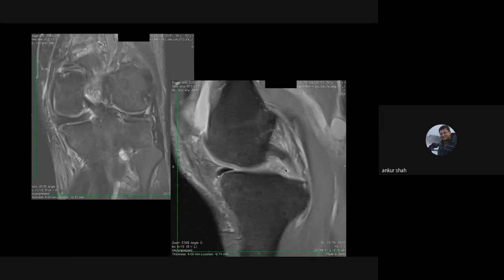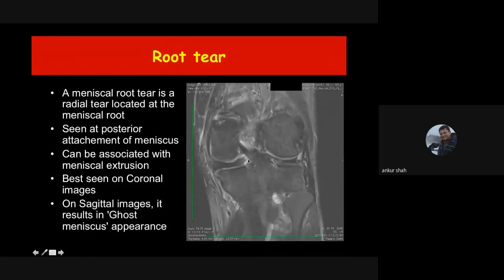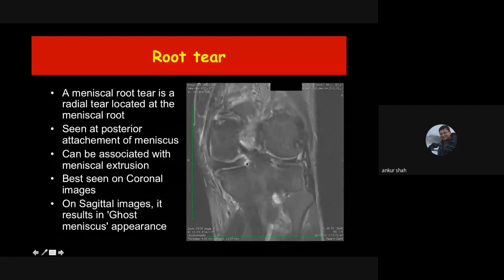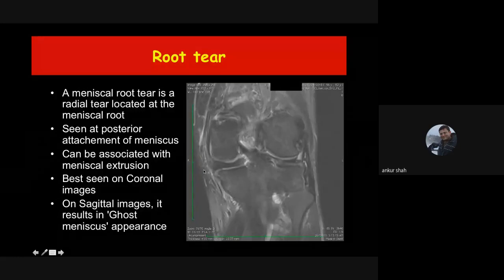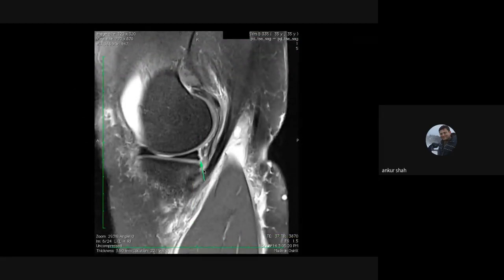This ghost meniscus sign is specific for a root tear — a tear at the posterior root ligament, which connects the meniscus with the intercondylar region of the tibia. When this ligament is torn it results in a root tear, which can cause extrusion of the meniscus out of the knee joint. Once there is a root tear, degenerative changes occur very fast because the cushioning effect of the meniscus is lost. Root tears are commonly associated with extruded meniscus and result in the ghost sign on sagittal images.